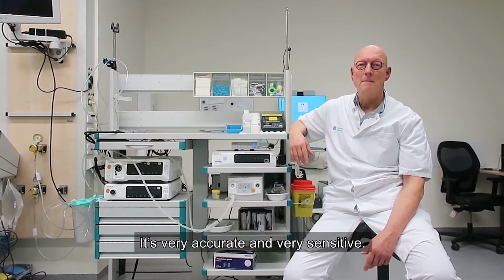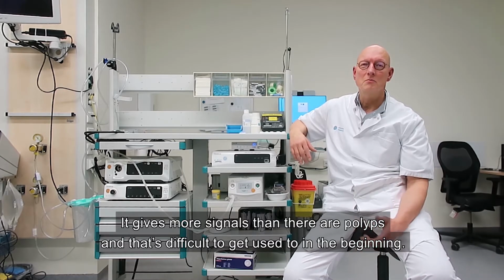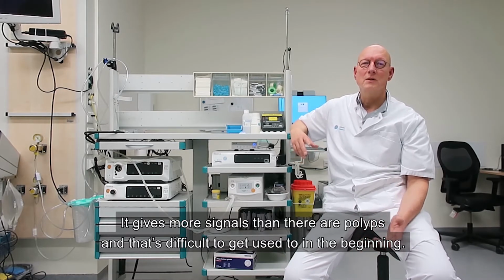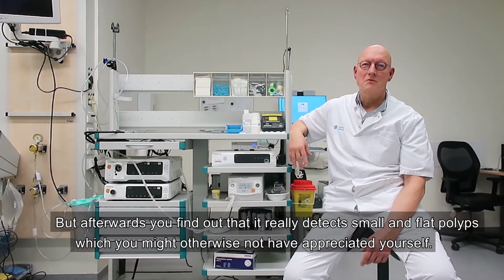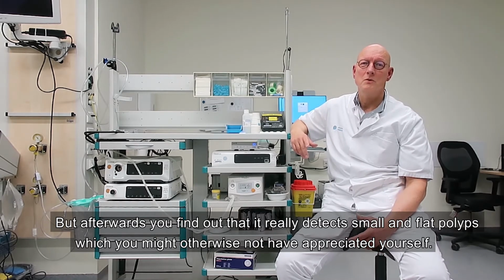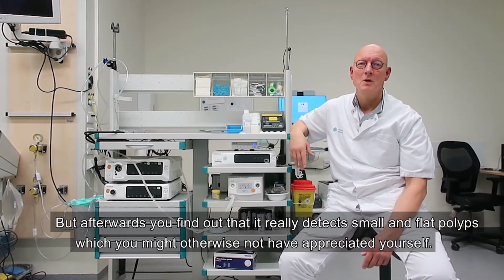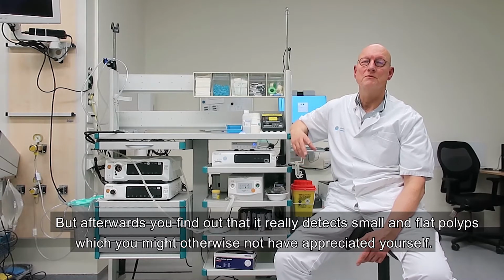It's very accurate and very sensitive. It gives more signals than there are really polyps, and that's difficult to get used to in the beginning. But afterwards you find out that it really detects small and flat polyps, which you might otherwise not have appreciated yourself.